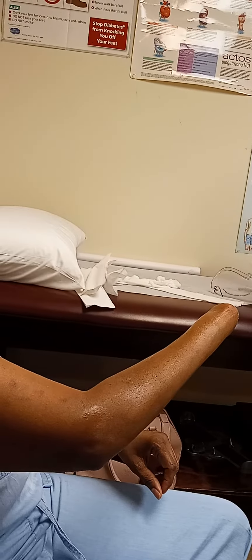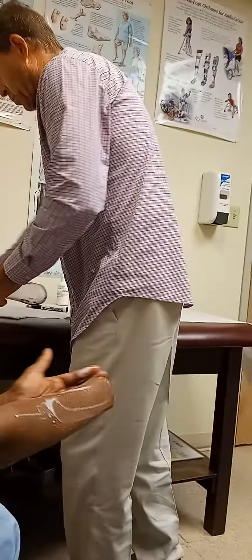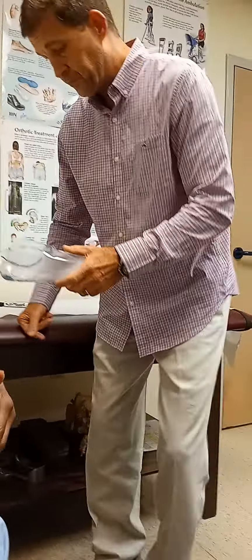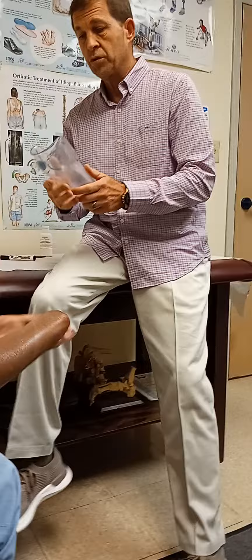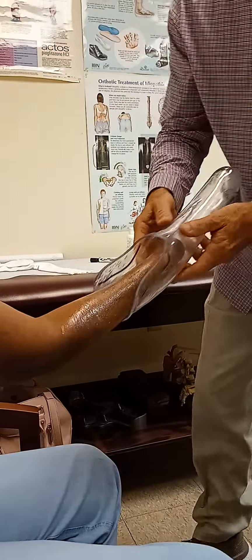I'm going to heat up a couple areas, and then we're going to try it on you again. I'll be back in just a few minutes. I'm going to make the socket a little bit bigger. But for right now, those couple areas that I just marked should be snugger here, tighter in these two areas right here, looser right here. So we should be fitting a little bit better, more comfortably.